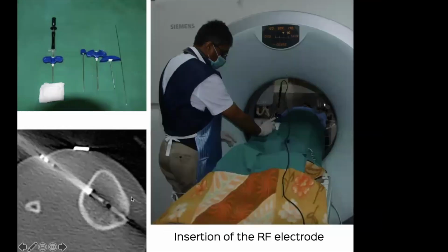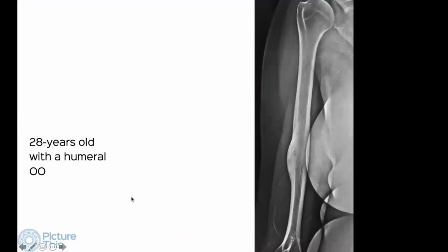And then we burn it at 90 degrees for 5 minutes, sometimes 100 degrees for 4 minutes. And that's it. That's pretty much the procedure. With the Boston needle, it's actually a little simpler.